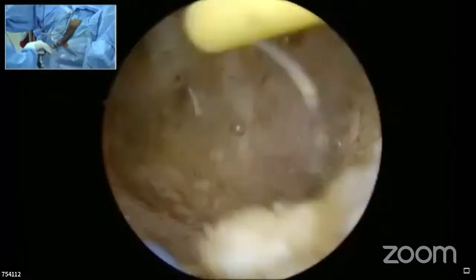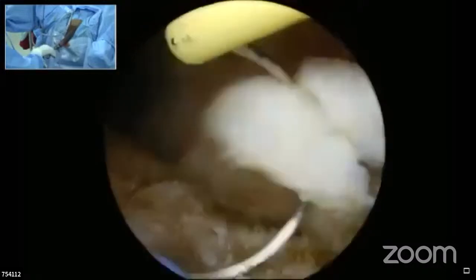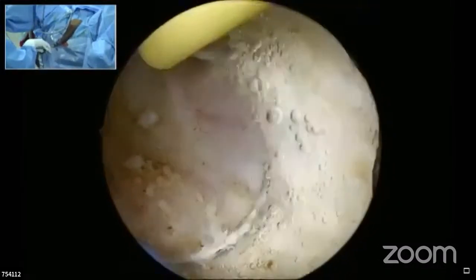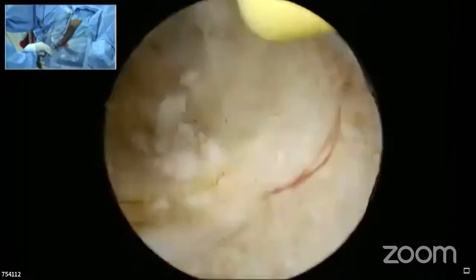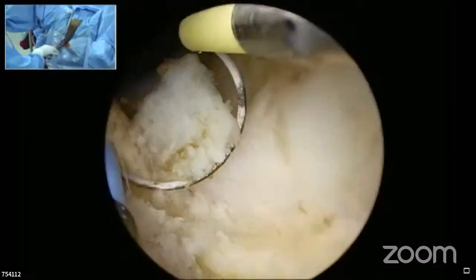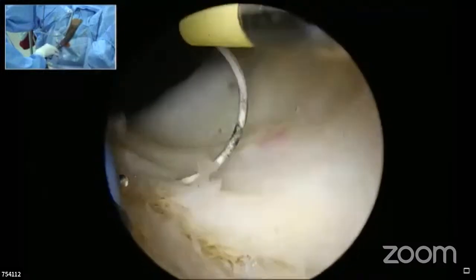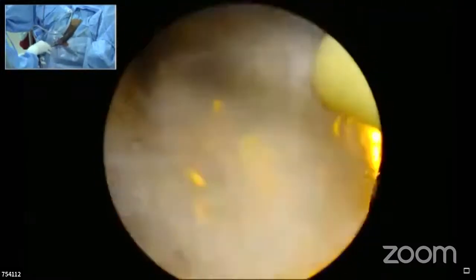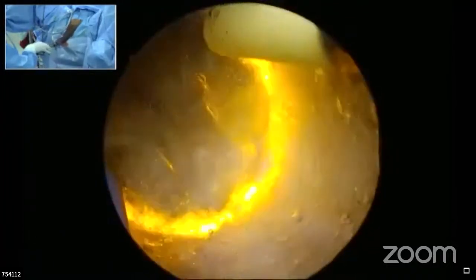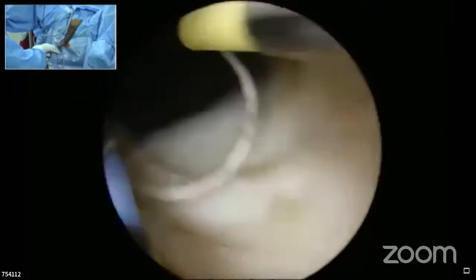Fulgurating the artery at the capsular level is much easier than within the adenoma. So this is one of the biggest advantages of doing this Nesbitt technique over the Barnes technique, because there the same bleeder you are fulgurating again and again. Here, if you are doing it at the capsular level, once is good enough. That's why this technique is good for the large prostate where you want to do faster resection. And you have a good vision under control, sir, majority of the times.